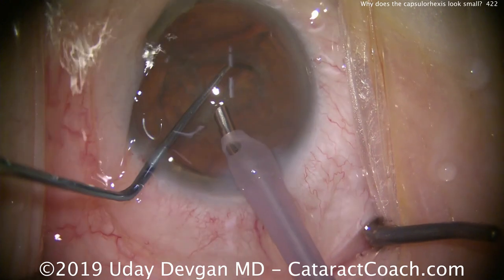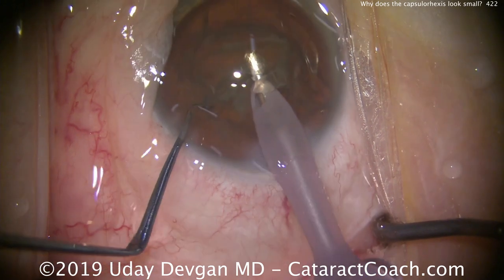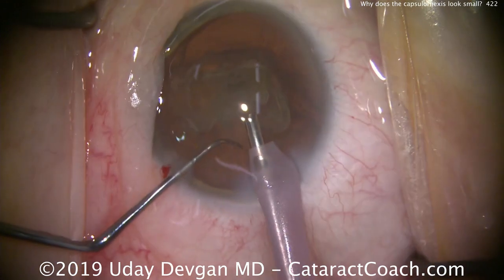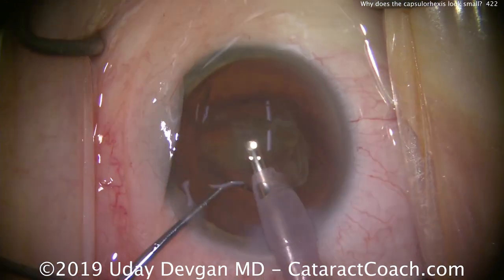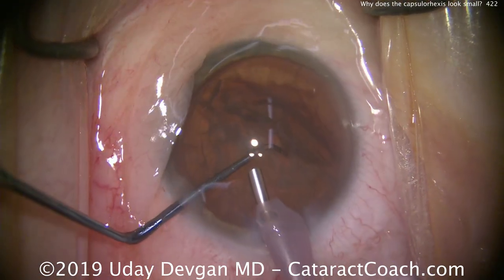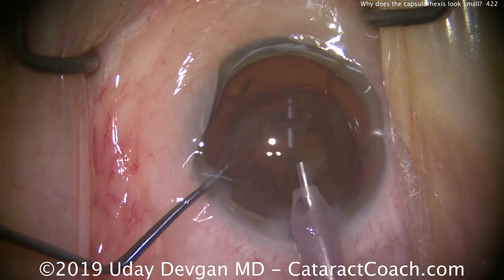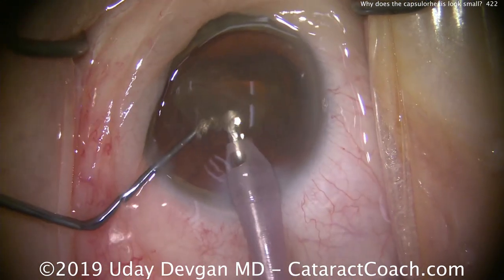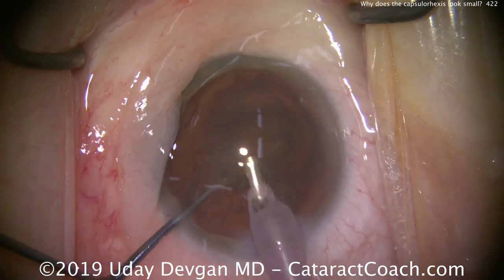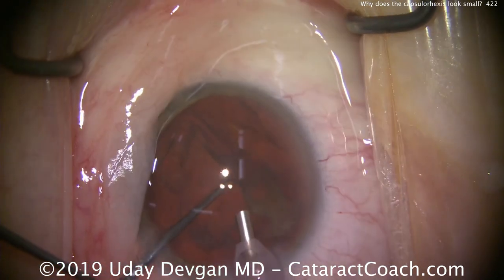This is a large nucleus, with a diameter of probably 10 or 11 millimeters, and this patient has a capsulorrhexis of five millimeters. Now why do we still make a small five millimeter capsulorrhexis? It's small in comparison to the size of the lens here. The answer is because of our IOLs. Even for this large eye, the IOL we have is a six millimeter optic. There is a foldable acrylic six and a half millimeter optic lens available in the US, but not in her power.